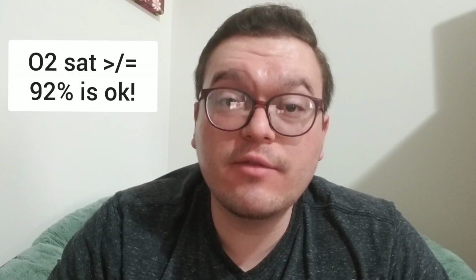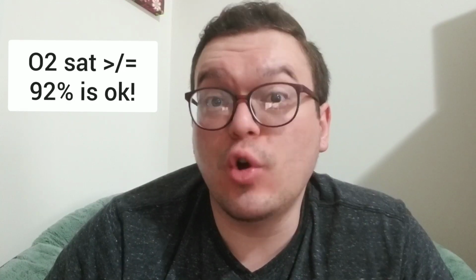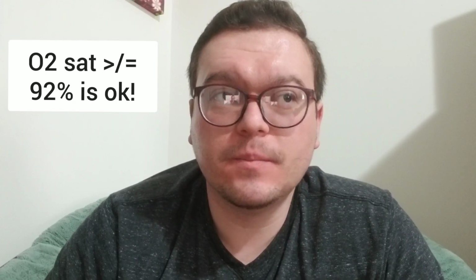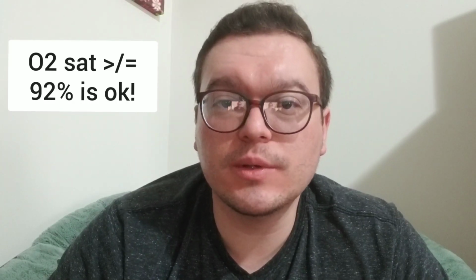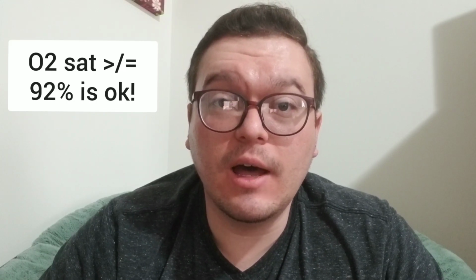Most respiratory therapists will usually start at 5. You can titrate up to 8, 10, 15 in some of these patients, at least, again, with the given recommendations, which change every single hour, almost feels like, and try to get them to a place where at least you can use an oxygen saturation. If you have a good waveform, a pulse ox of above 92%, you should be okay with. That being said, it shouldn't be your goal to get them down to 92% either, but if they're sitting at 100%, they're getting plenty of oxygen. You don't have to be so concerned and keep them at 100% FiO2. You can down-titrate that until it's tolerated.